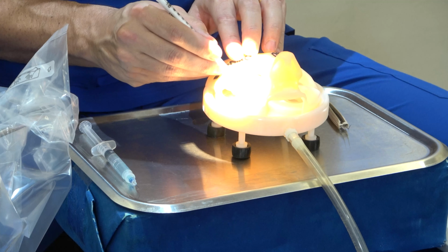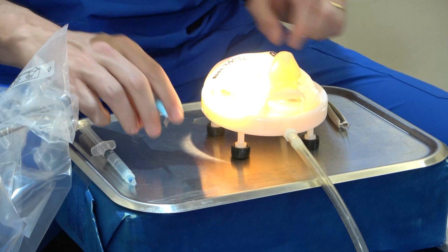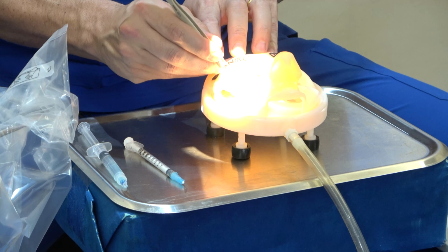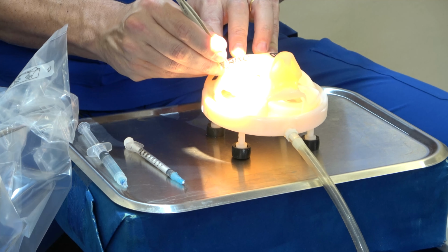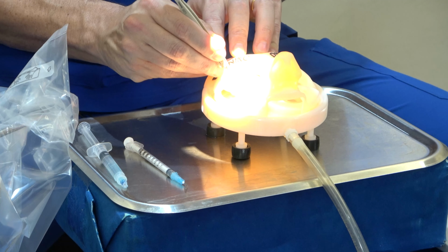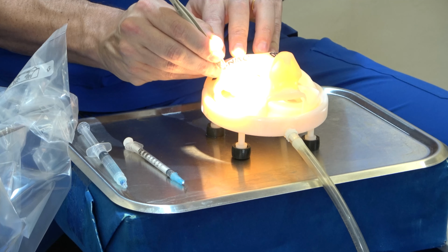Right here, you always need to remember that this is simulated surgery. It could be something different from the human eye, but the important thing here is to learn, to understand the model. In this case, this is going to be a white cataract.